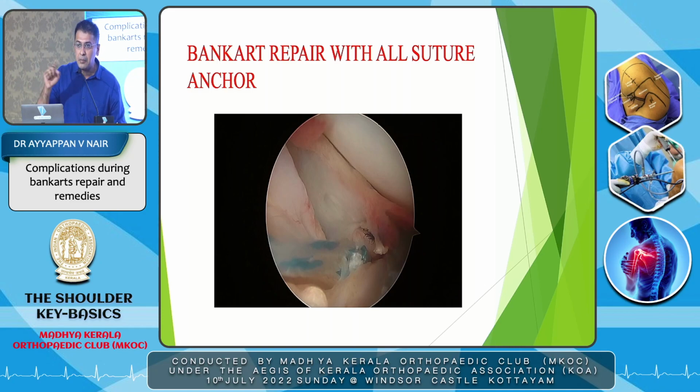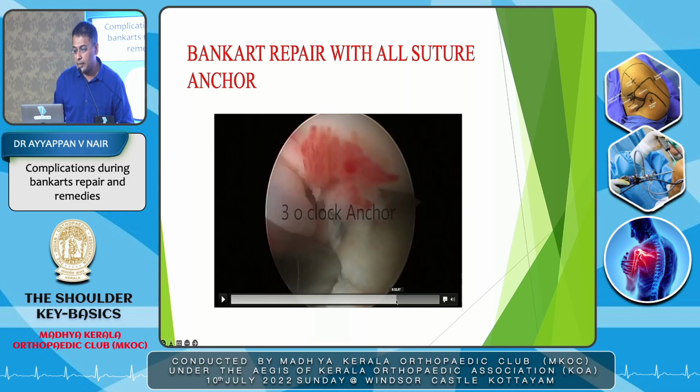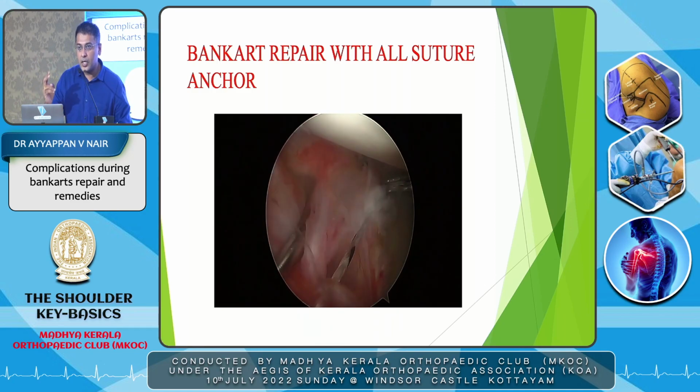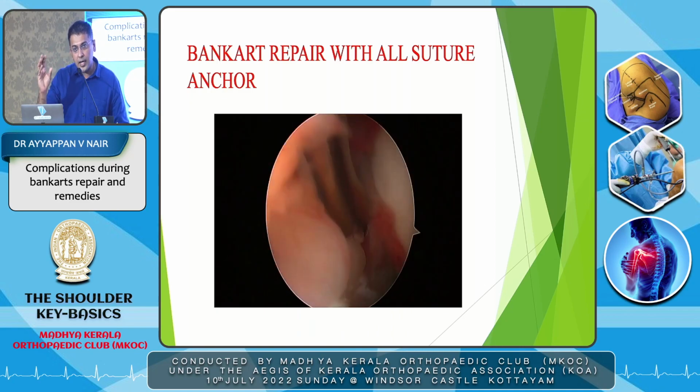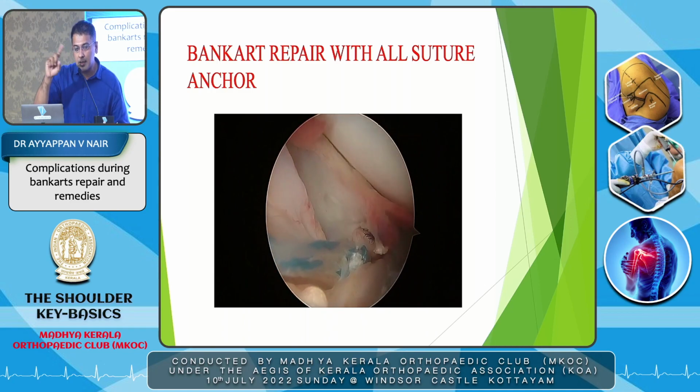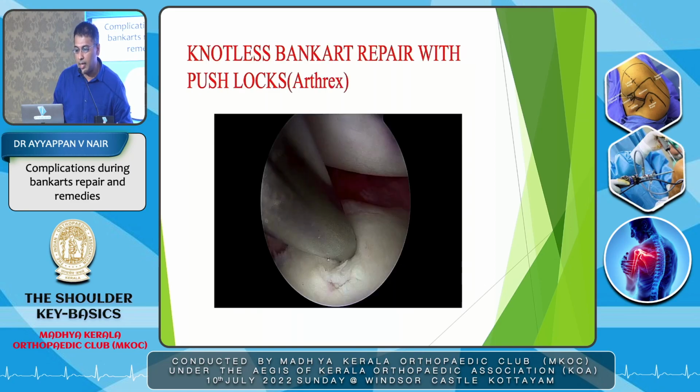And the second part of my, the first one I've used as a mattress. The second one I would use a simple pass, okay, which I had shown here. This simple pass, what I would do is, that is my bumper. So I'll repeat again. At 5 o'clock, the first is my mattress, a good bite with the scorpion. The second one is a simple suture and a bumper. So I get both my bumper and my plication. So that is, I feel, the key.